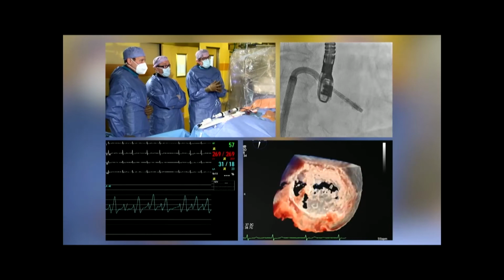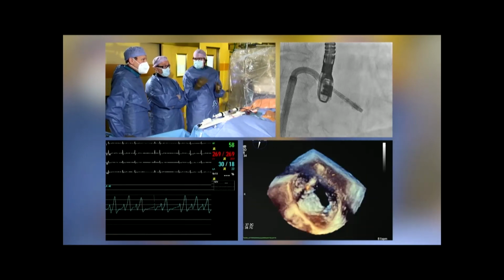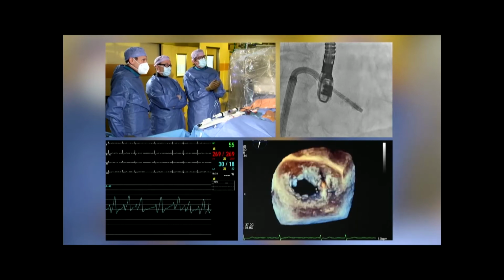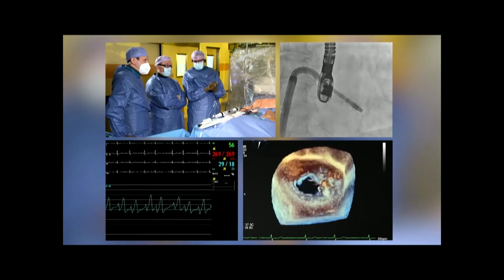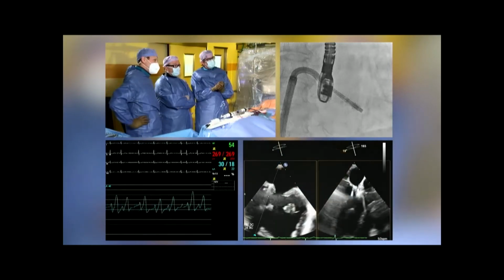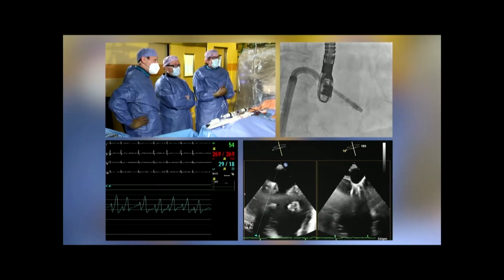Okay. May I suggest the following? We do another breath hold. We open the device. We will not lose position. And then we can bring up the clasp very gently and then try to be a little bit more medial. What is your rationale to do this? Just to explain it to the audience.